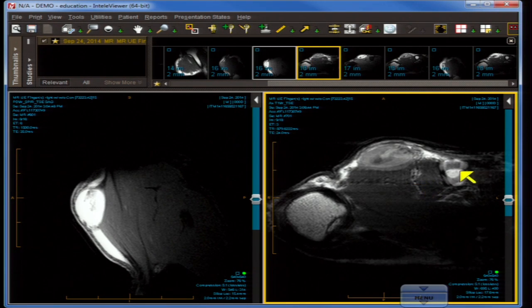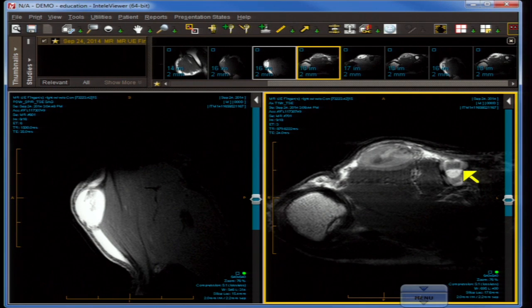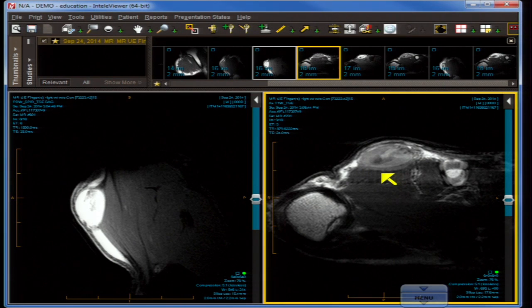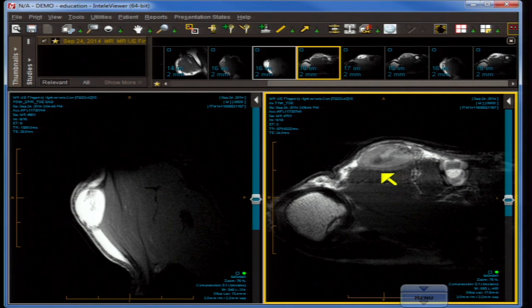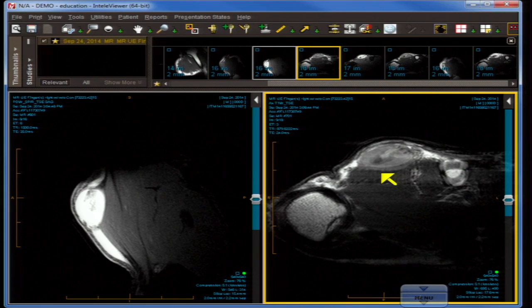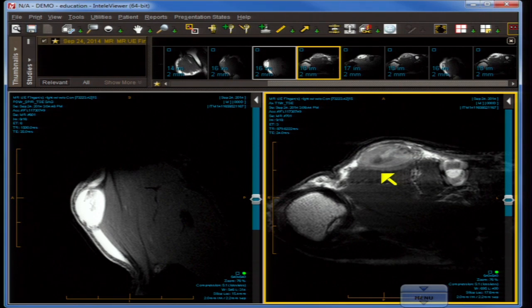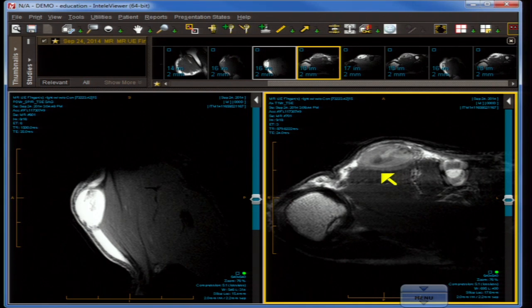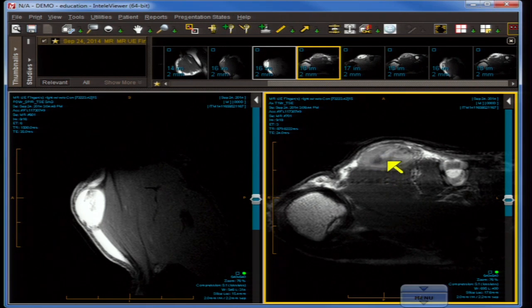Although the patient has moved a little bit and there's some pulsation artifact, the mass — which was not given contrast on this image — is a little hyperintense, suggesting either a high protein content or dilute hemorrhage. The differential diagnosis might conjure up a ganglion, although this would be a very unusual place for one. A ganglion is a pseudocyst, so the T1 signal should be lower, and you shouldn't see these globular areas of lower signal intensity.